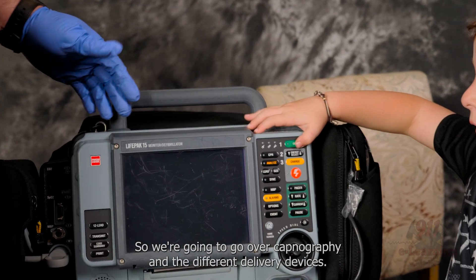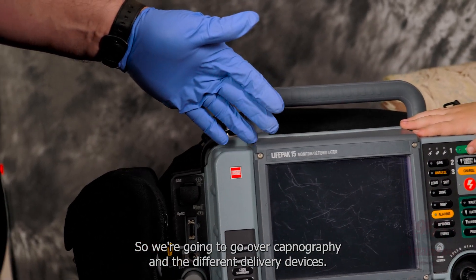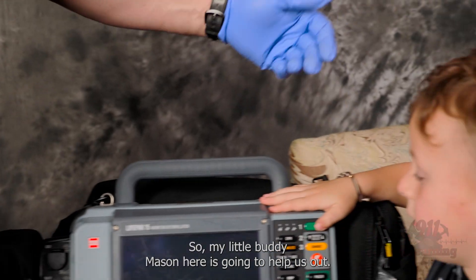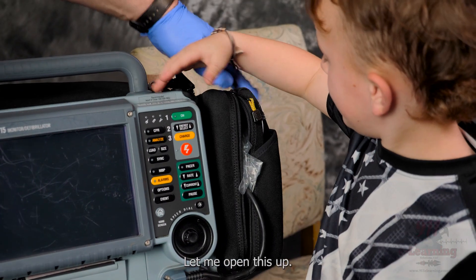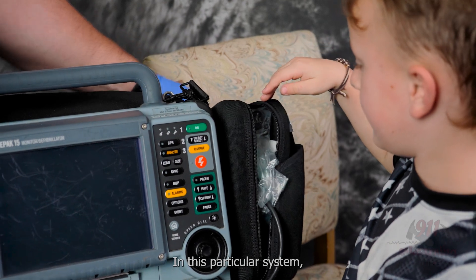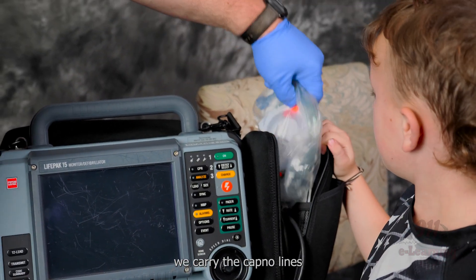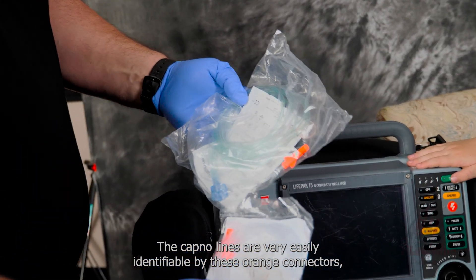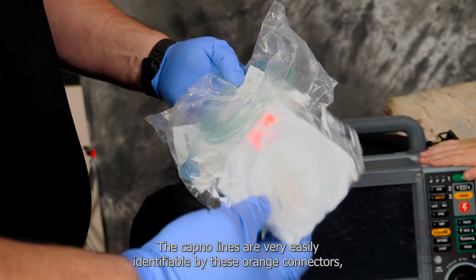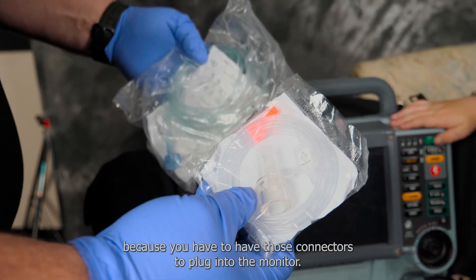We're going to go over capnography and the different delivery devices. My little buddy Mason is going to help us out. In this particular system, we carry the capno lines on this side of the monitor. The capno lines are very easily identifiable by these orange connectors, because you have to have those connectors to plug into the monitor.